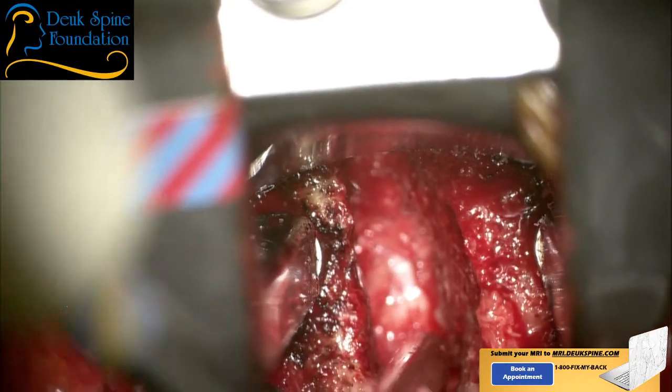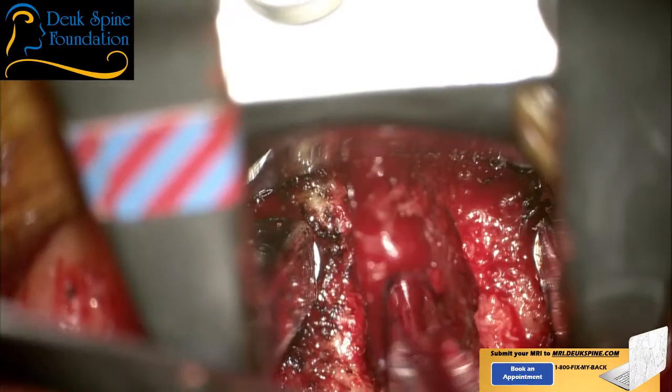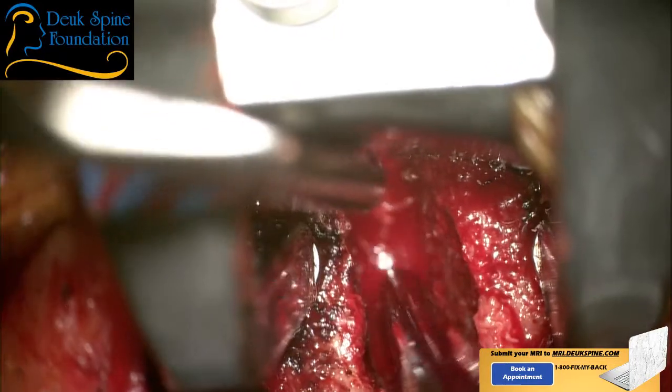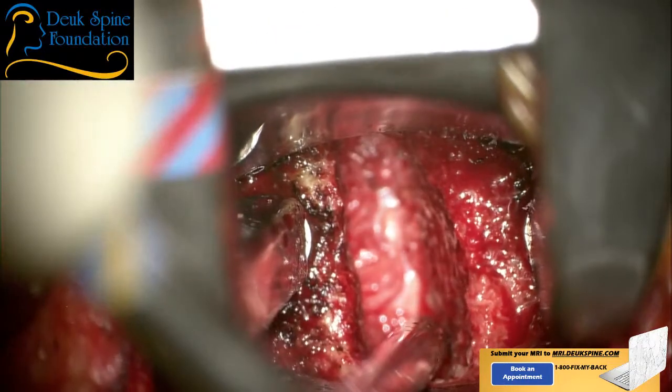Okay, good. Now we're really starting to see the spinal cord. That is the dura around the spinal cord, folks. I'm going to open up his left side. Show me. Keep going. Yep, perfect.